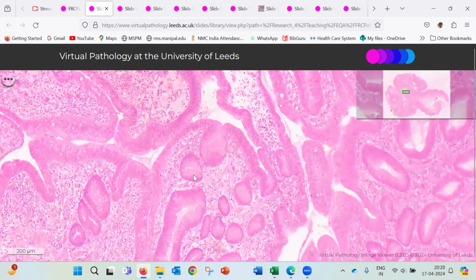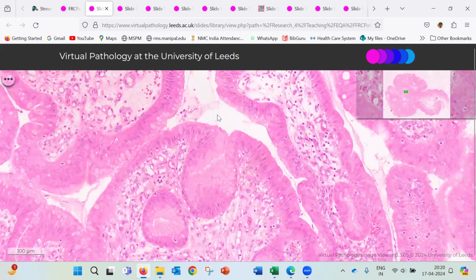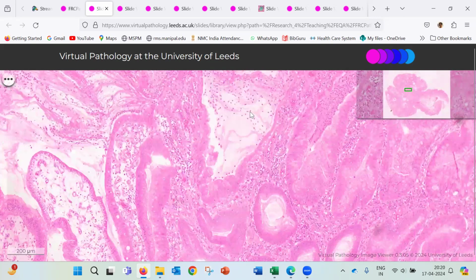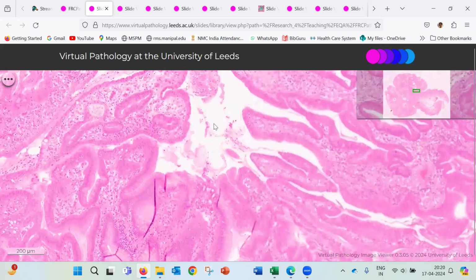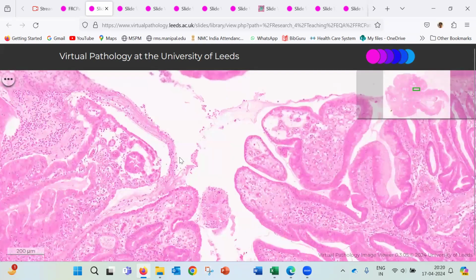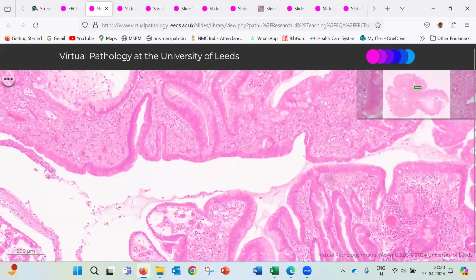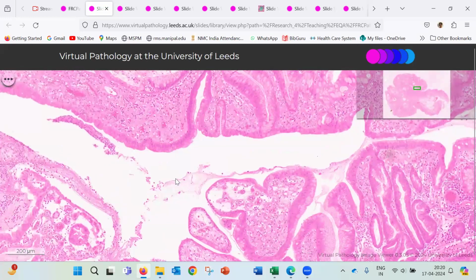You should rule out the possibility of Helicobacter pylori associated infection, and you should say that I will look at deeper sections to conclusively rule out any areas of dysplasia, because I know that dysplasia can happen in a hyperplastic polyp. The main thing is to rule out any possibility of dysplasia, particularly for this case.